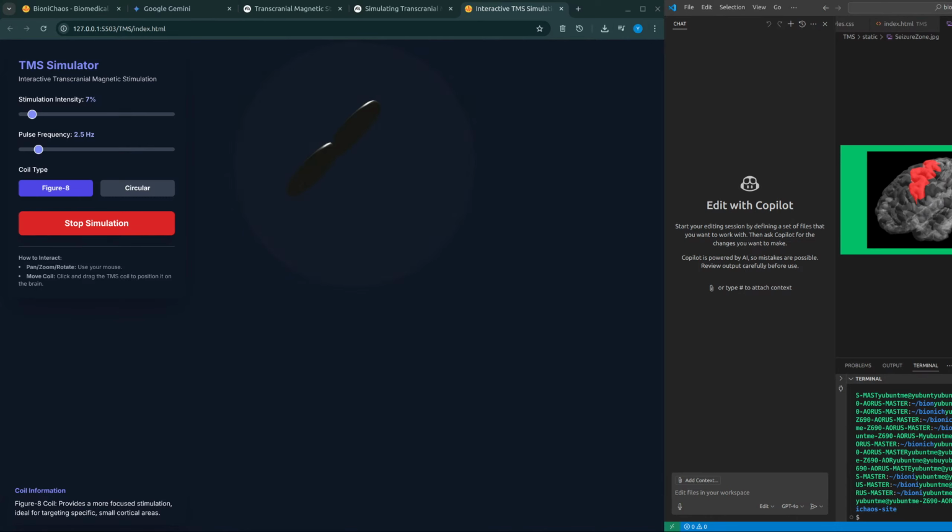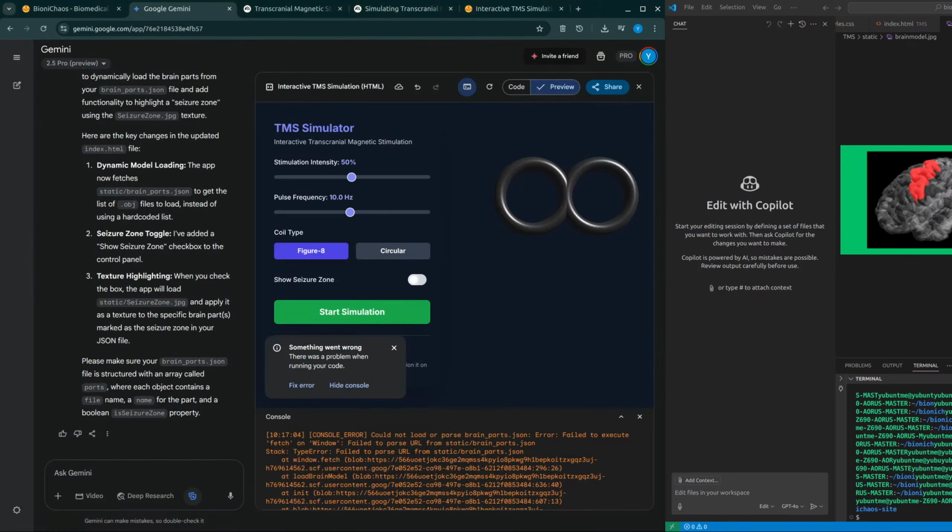Ah, okay. So like the brain itself, the skull, scalp, the fluids. Precisely. They all conduct electricity differently. They all have unique shapes in each person. So without an accurate map of that whole landscape, you just can't predict how the magnetic field translates into that crucial electrical field inside. Okay, that makes sense. You need this incredibly detailed map.